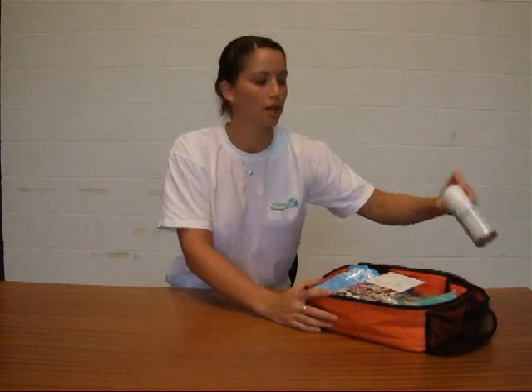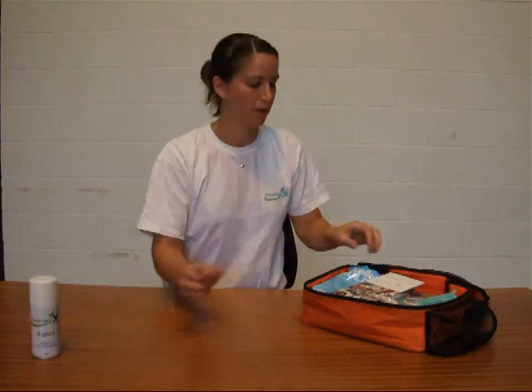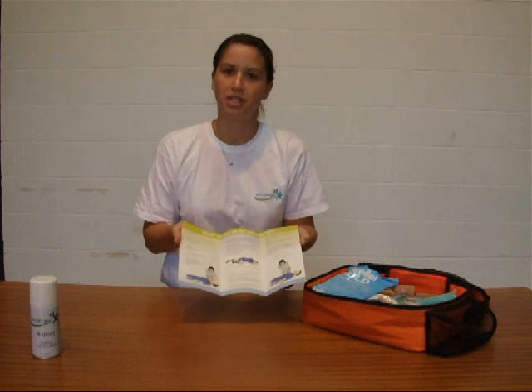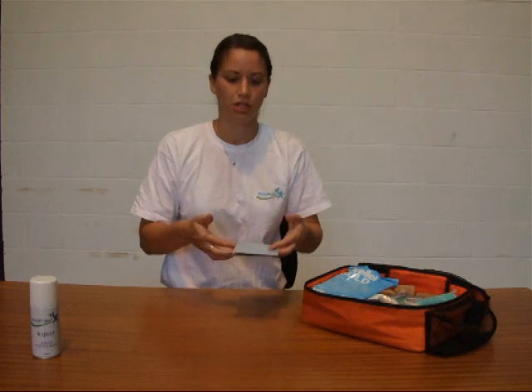We've also got a pocket on the side, great for holding your freeze spray — good for twists and turns and things like that. We've also got our guidance leaflet there on the top. It's got all the information you might need in an emergency situation, so that's a great little aide-mémoire just to have to hand.